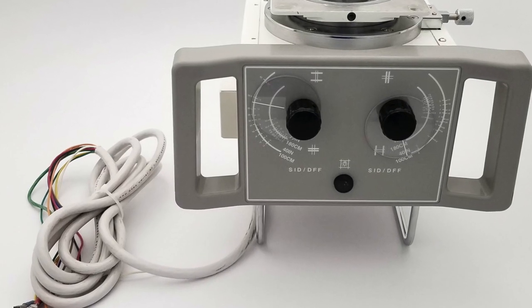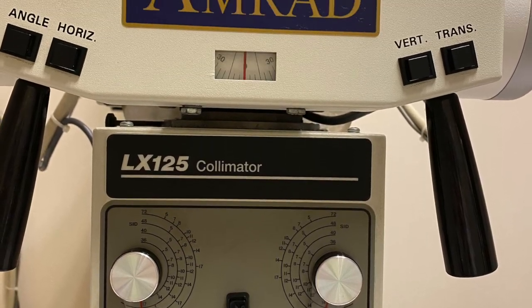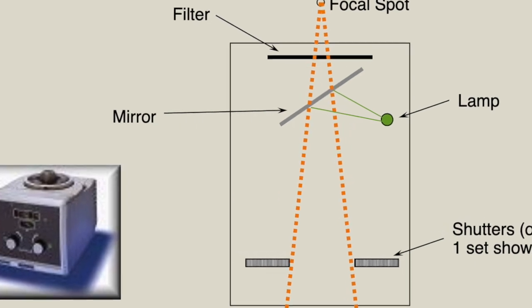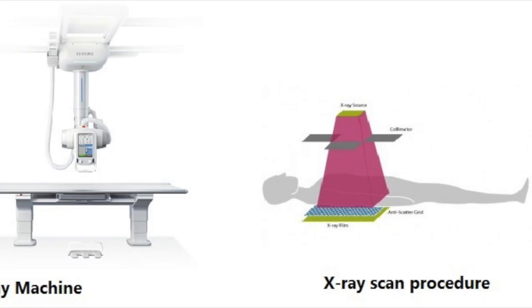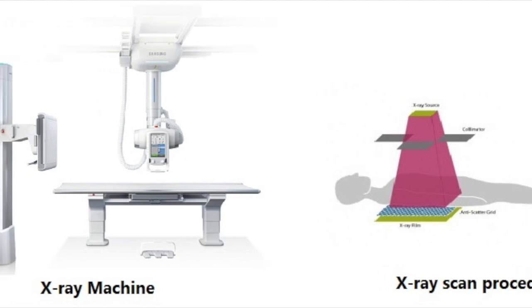A collimator is considered the best type of beam restricting device available in radiography. A collimator is composed of 2 or 3 sheets of lead shutters which can be located below the X-ray tube window. The use of a beam collimator is referred to as collimation.